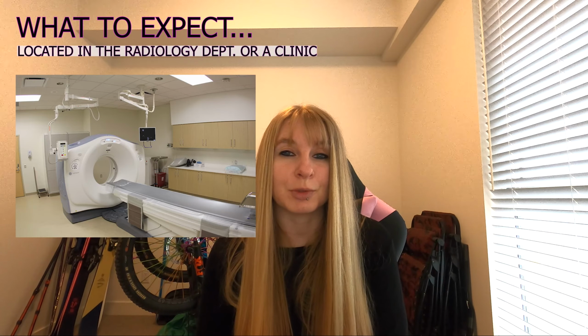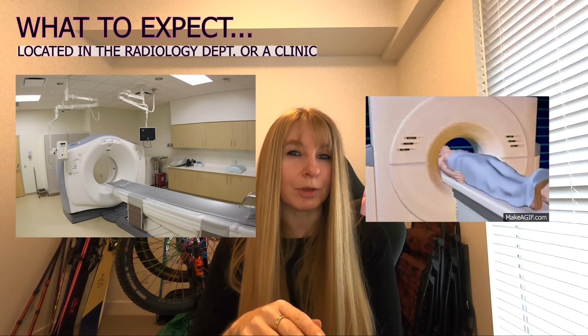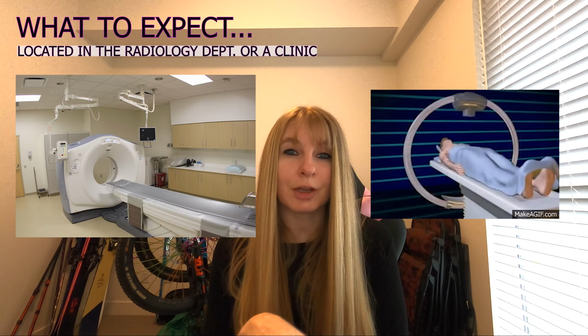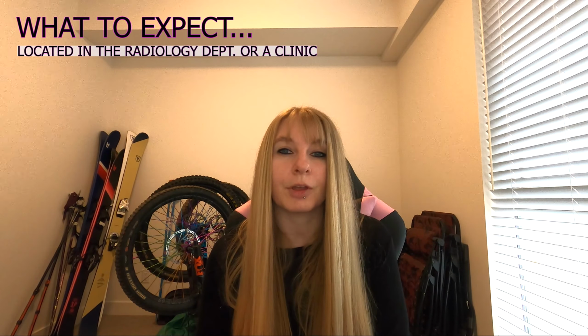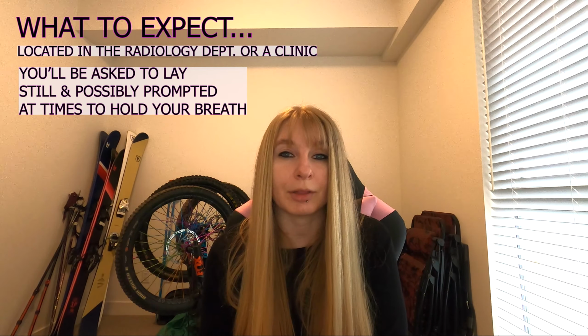So you'll always find CT in the radiology department of a hospital, or you'll go to a radiology clinic. It involves you laying on one of those movable table beds that slowly moves through the donut-shaped scanner machine, which is the CT. This will be where the X-rays will rotate around your body, so it's possible to hear whirring sounds while you're in there. You'll be asked to lay very still, and depending on the part of you that's being scanned, you may be asked to hold your breath at points.